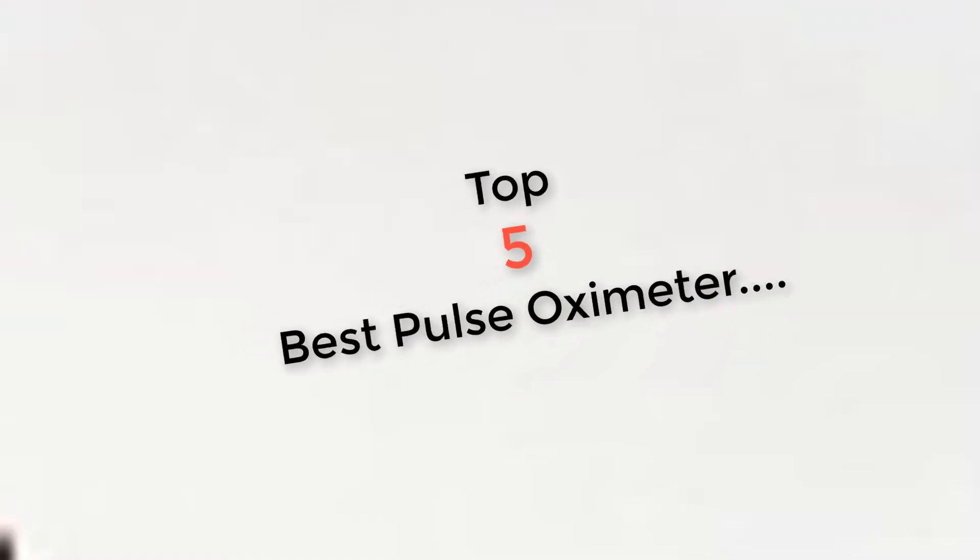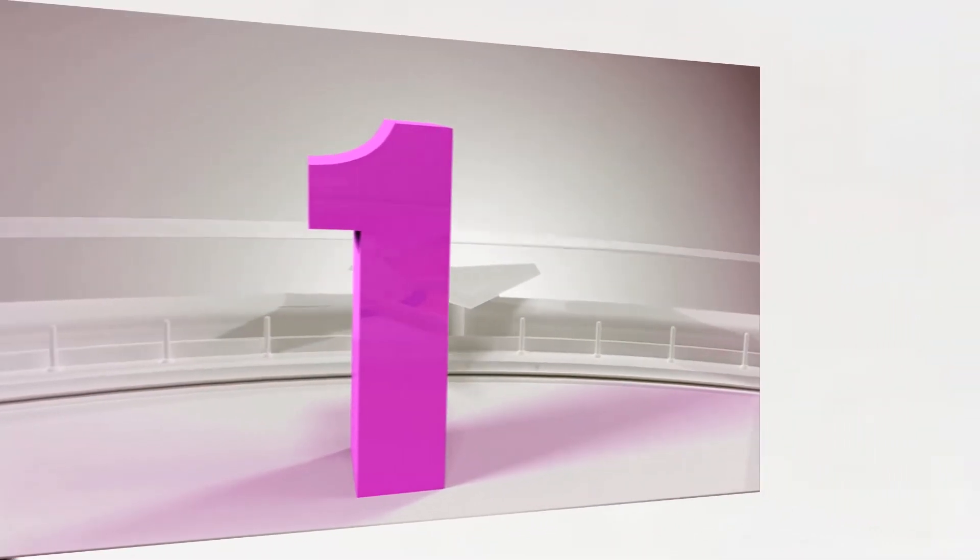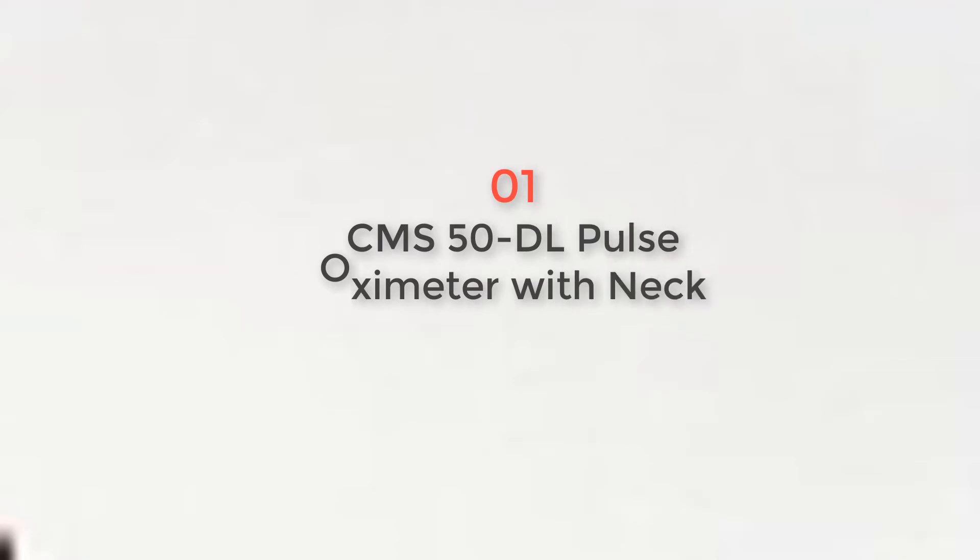Top 5 Best Pulse Oximeters. Product Number 1: CMS Pulse Oximeter with Neck.